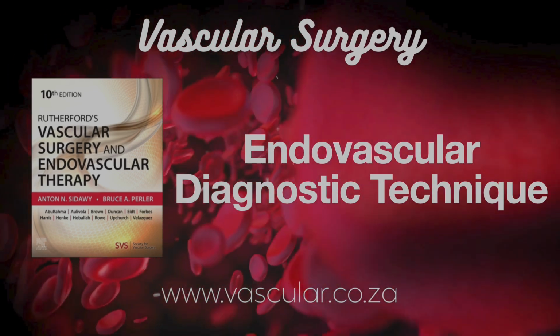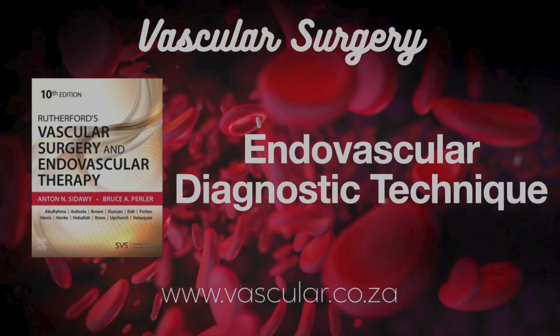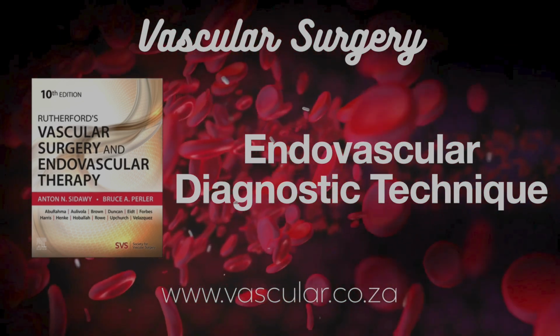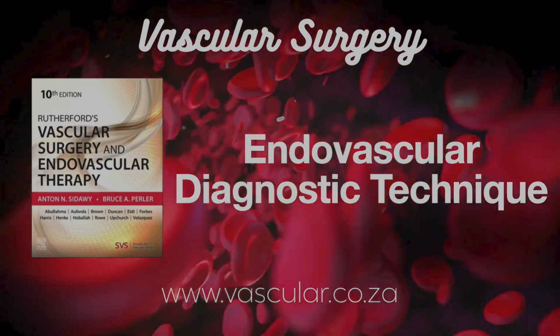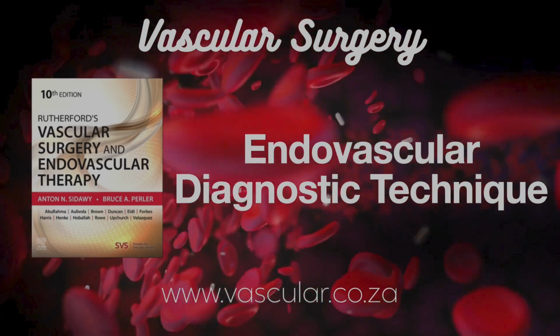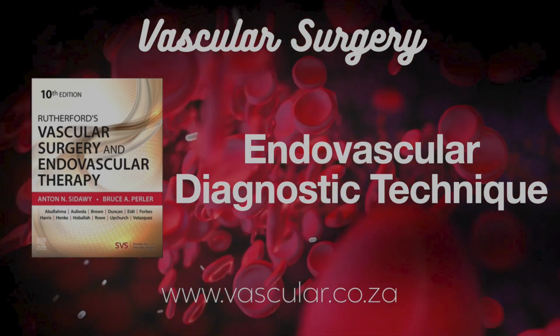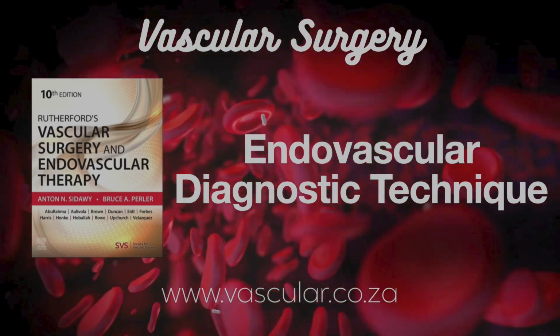Okay, shifting gears. Fistulography for dialysis access. Right. Used when a hemodialysis fistula or graft isn't working well, or a new fistula isn't maturing. How do you access it? Direct puncture of the fistula graft itself. Choose a spot that lets you see everything and potentially intervene. Pre-op ultrasound often gives clues to the problem area.